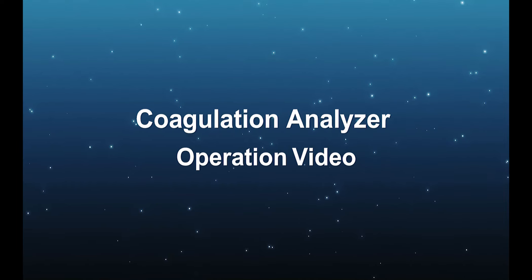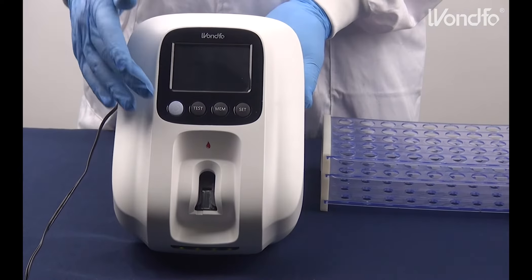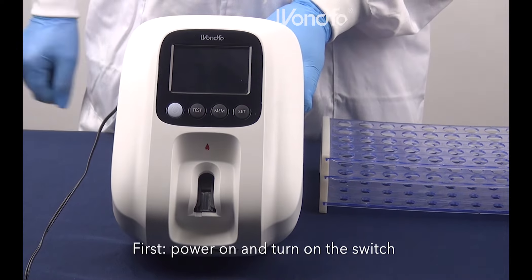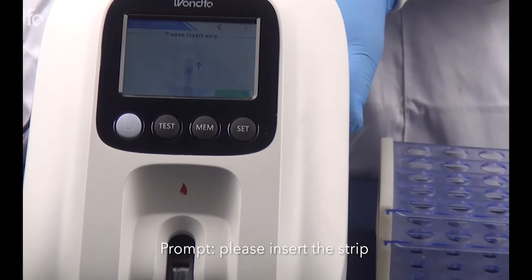Welcome to Wonderful's coagulation analyzer operation video. First, power on and turn on the switch. Please insert the strip.